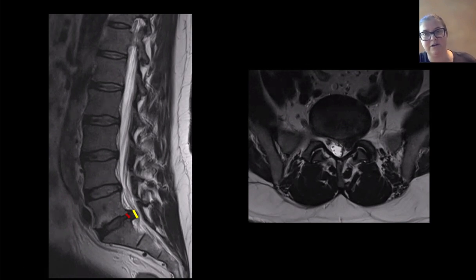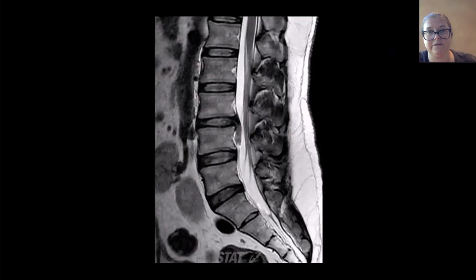But Derek, I do not disagree that I have seen other people, instead of contact or communication with the parent disc, use the base. I have also seen protrusion. So disc extrusions can migrate. Protrusions should not migrate. So you shouldn't have any disc above or below the disc space. But again, I don't disagree. I have seen some confusion between lectures that I've watched and the literature.